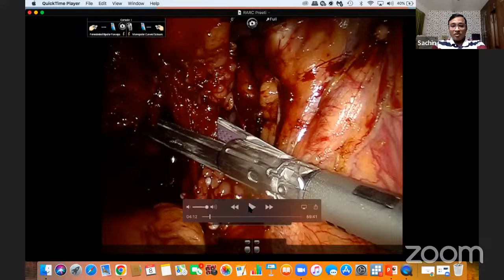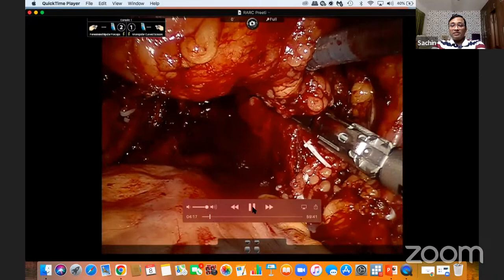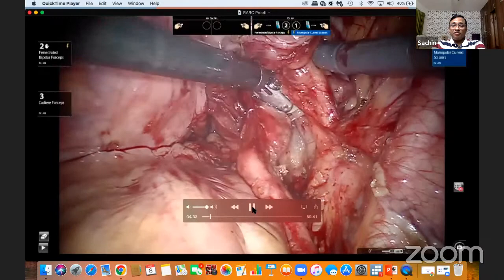Here I'll be showing endo-GI and Hem-o-lok. Preferably Hem-o-lok when the patient is sexually active and I am doing neobladders. If I'm doing a conduit, I go with staples. So this is a 60 mm endo-GI stapler. You can see the pedicles are taken care of in one go. This is the right side. This is the left side. If you are planning a nerve-sparing cystectomy, I would go with Hem-o-lok clips.